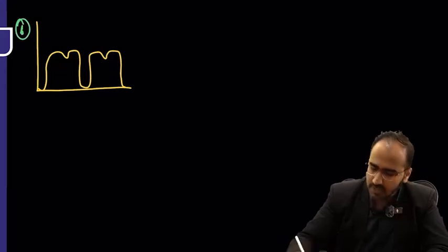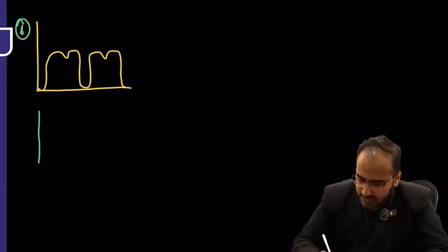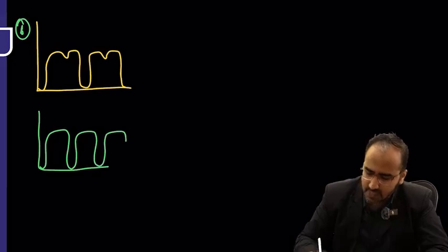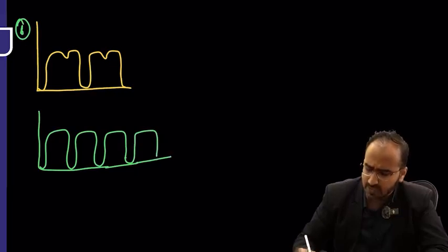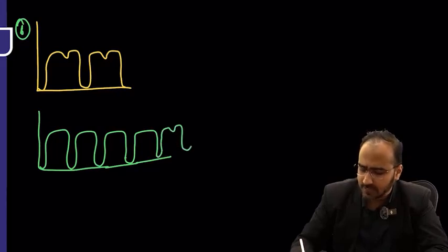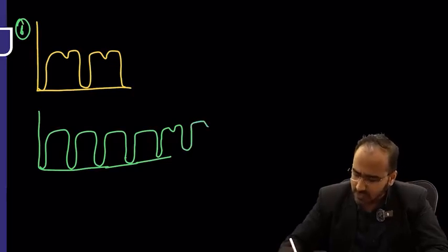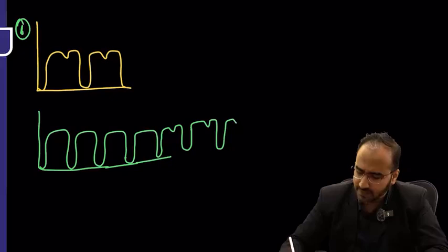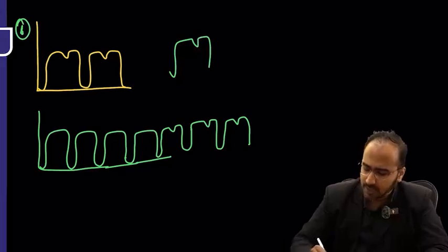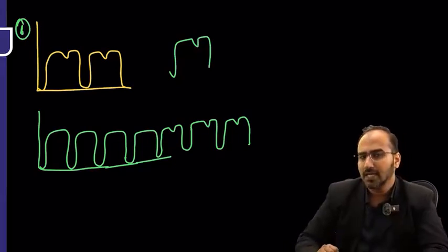This capnograph. So basically I'll give you a case. Just look over here. After intubation, you are seeing a normal capnograph like this. Then in the maintenance phase also, you were seeing this capnograph only. You were happy, patient was happy, everyone was happy. Okay? Then after 30 minutes, suddenly you will see this kind of capnograph developing. That means something abnormal is happening over here in the alveolar plateau phase.